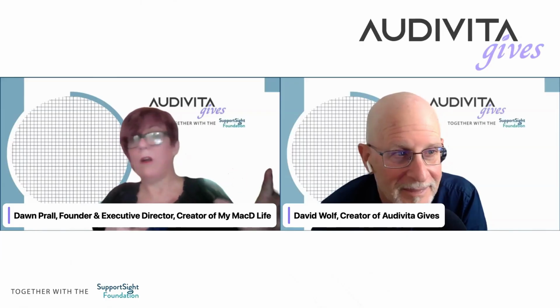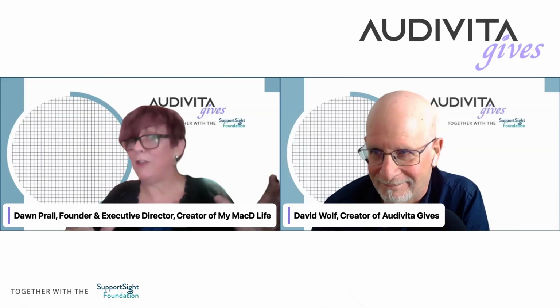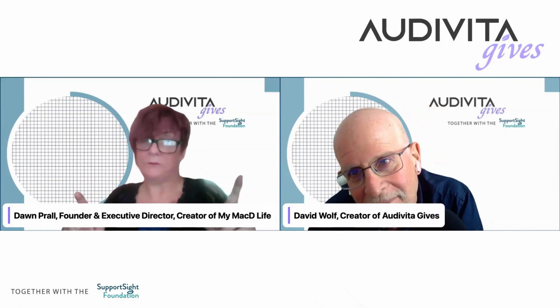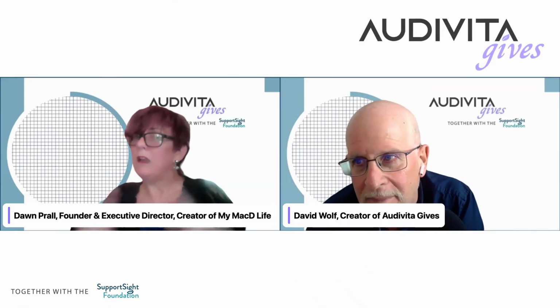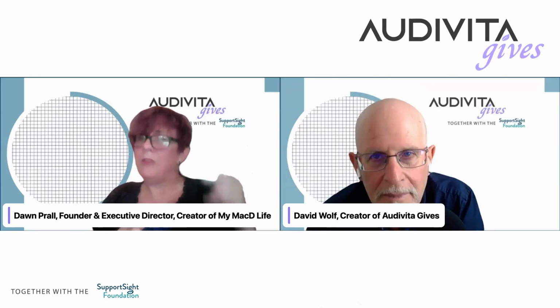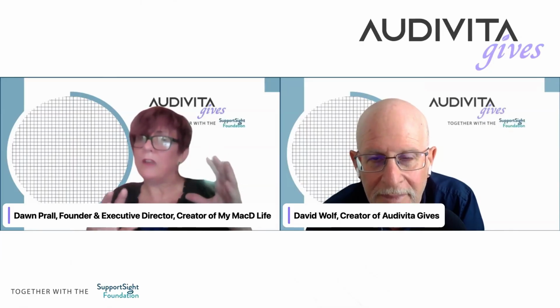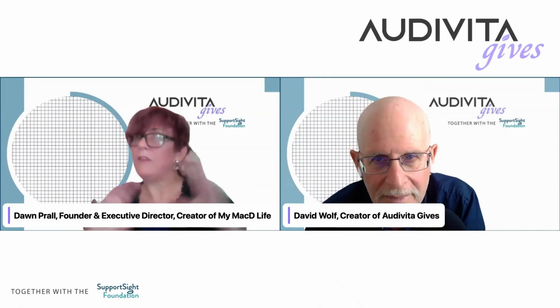I tell people, with your coffee and your juice, maybe your egg or your granola or your yogurt, whatever you're eating, the healthy diet, sit down in a place where there is lots of natural light. Now, for those of you who have macular degeneration, depending on the stage, beginning, intermediate, or advanced, glare might be an issue. Natural light might be an issue, but you've got to have enough light to do the Amsler grid. So whatever that means for you.